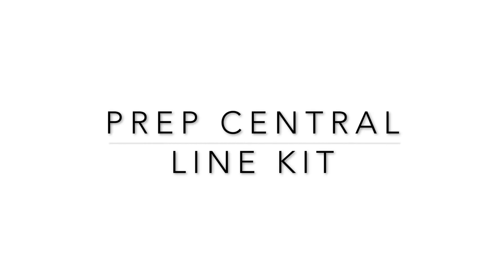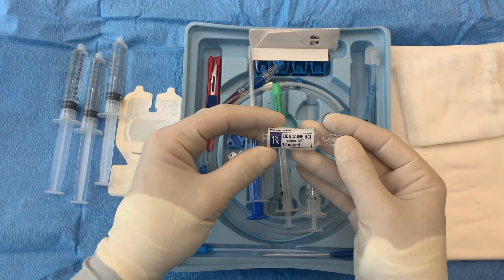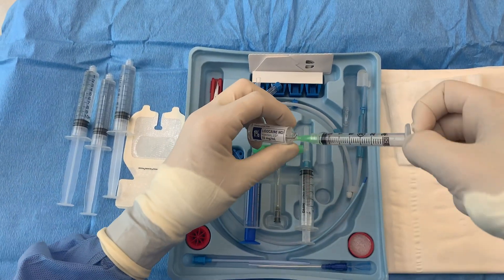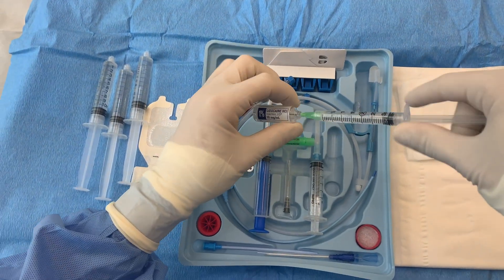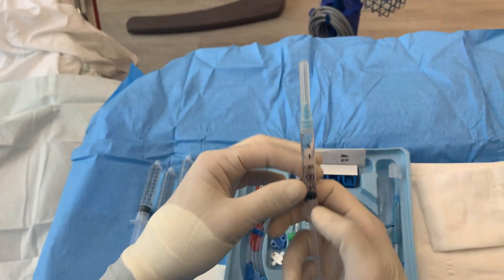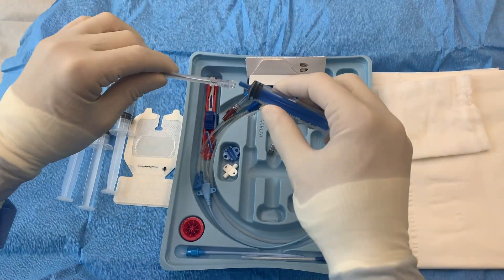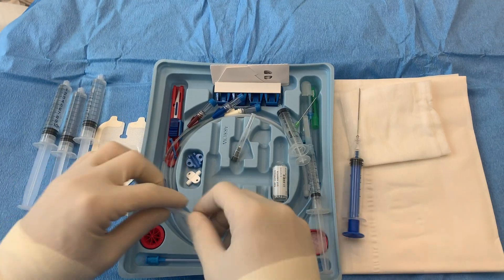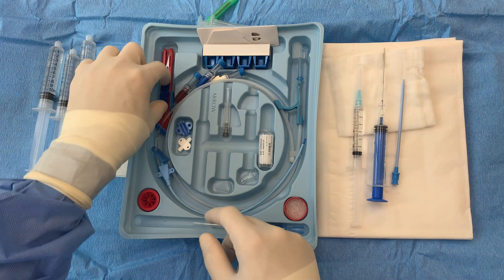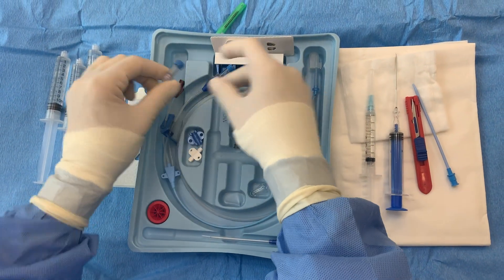Set up your kit according to the provider's preference. If inserting a central line catheter before the patient is anesthetized, draw up two to three milliliters of local anesthetic to improve the patient's comfort during insertion. During setup, it is a good idea to familiarize yourself with the items provided in each kit. Begin by connecting needles to the appropriate syringes and, for beginners, lining up each item in order of its use so that you are prepared for the procedure.